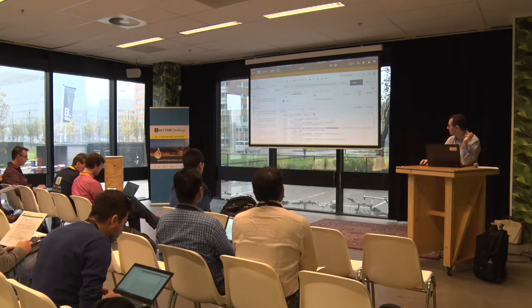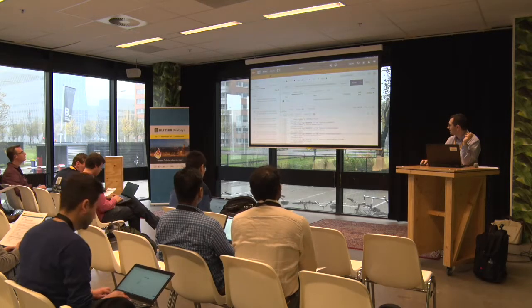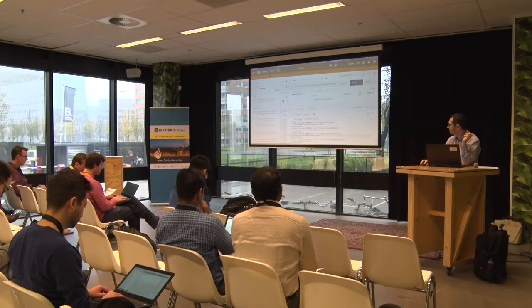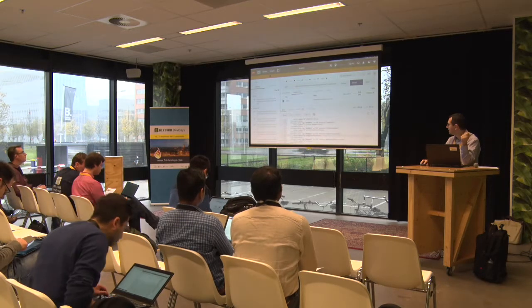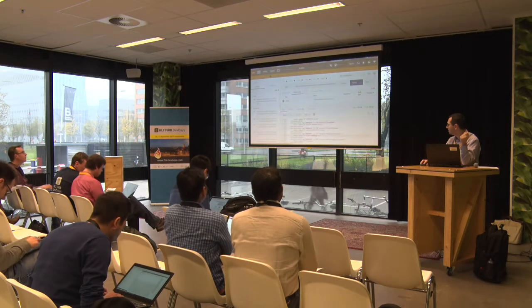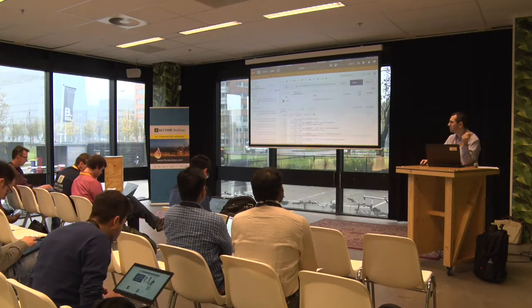Yeah, and there's, in this case, modalities in study. So CS is a code string, I believe, right? Yep. So in this case, the modalities in this study are CT, so literally a CT scan, KO, which is key objects, and then, I don't remember what PT is, another kind of image.